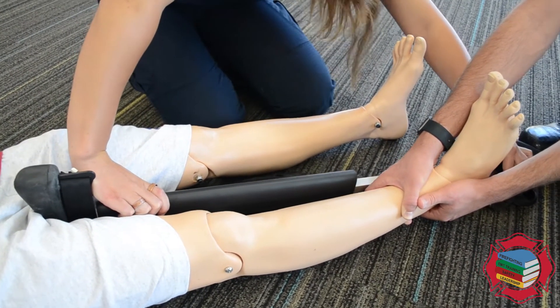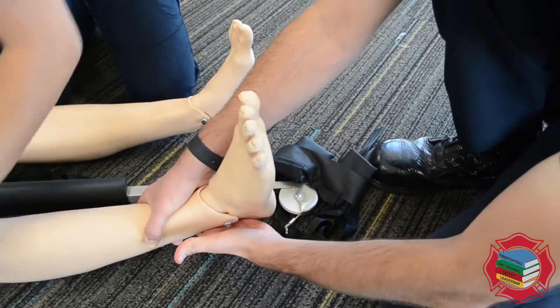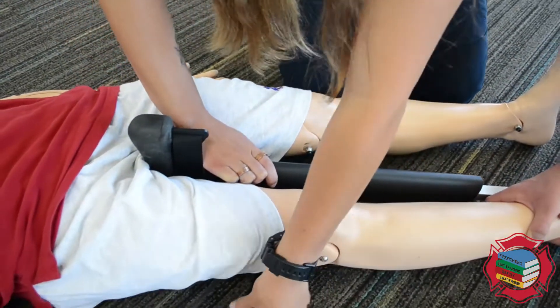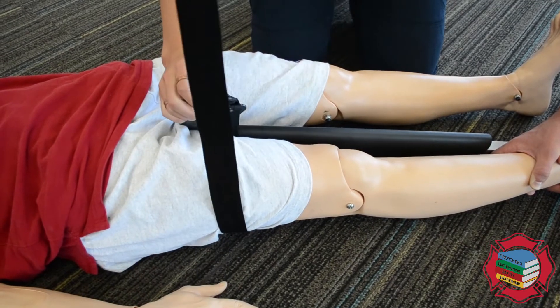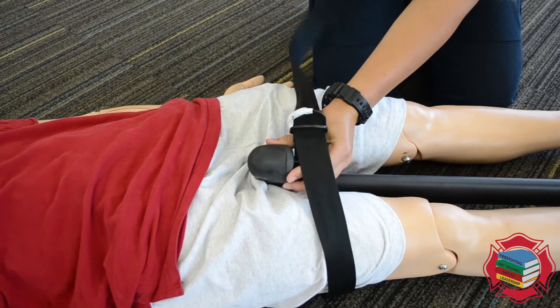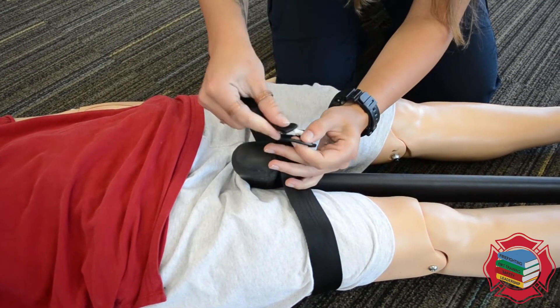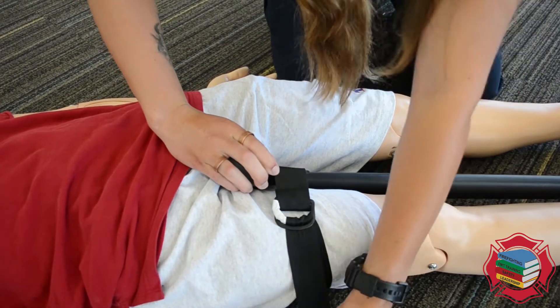You can see the wheel is just past the heel. While he's still holding traction, we're going to feed the strap under his knee, go up, pull it secure enough, and pull that tight, nice and secure.